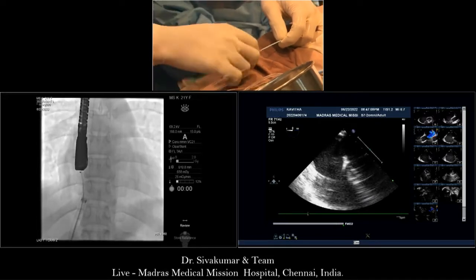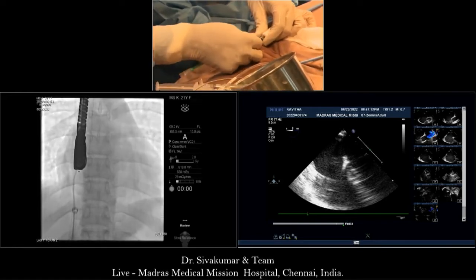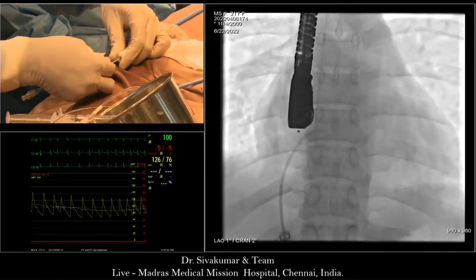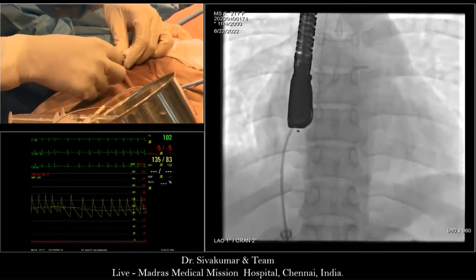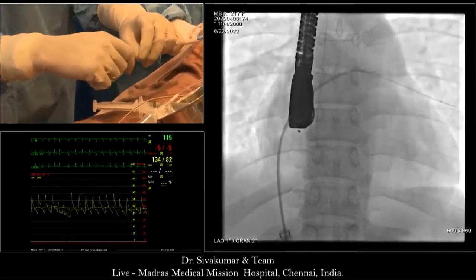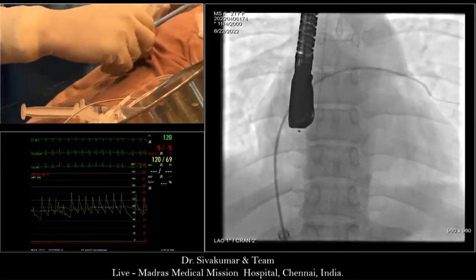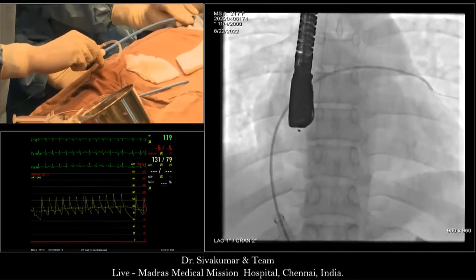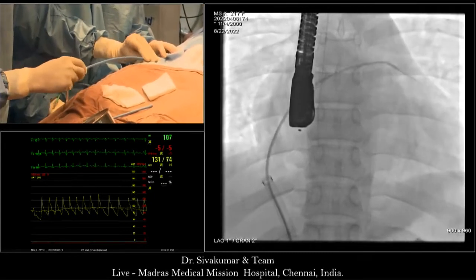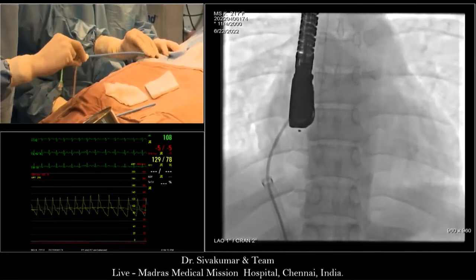Oh, I thought he was delivering the device, still the catheter. No, I pulled it out to the inferior. Whilst you're doing that, just out of interest, Bharat, you said balloon assisted, I was thinking whether you would do a right upper pulmonary vein. Even this technique is very good what he's doing, and more or less he's doing it predictably. The problem about the left superior or right superior pulmonary venous technique is it is not so predictable.